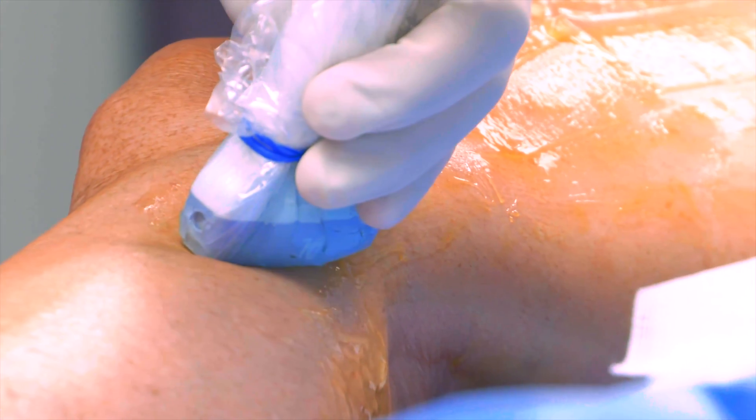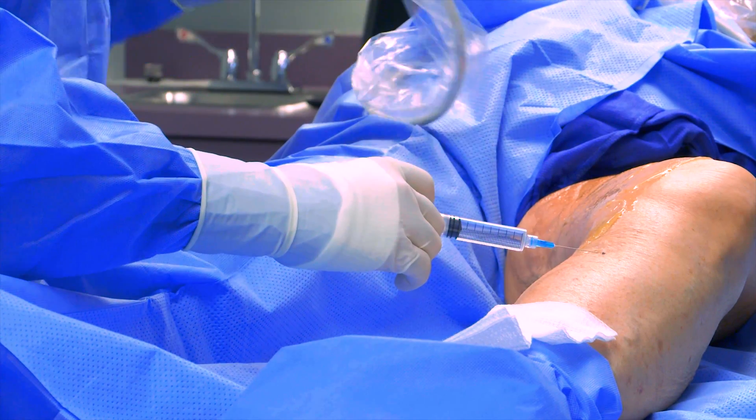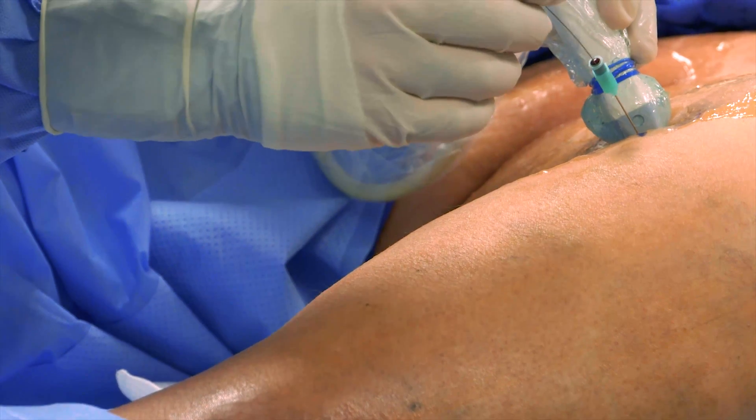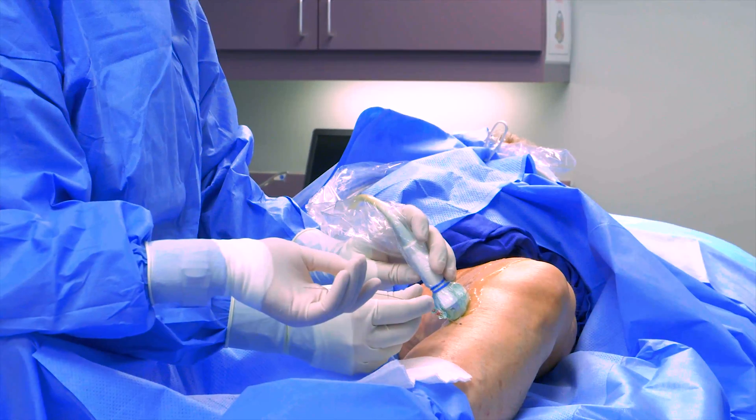Dr. Faber will inject a small amount of local anesthetic called lidocaine at the insertion site. A very thin needle will be used to access the vein, similar to starting an IV. Then a very thin wire is floated through the needle into the vein, and the needle is then removed.